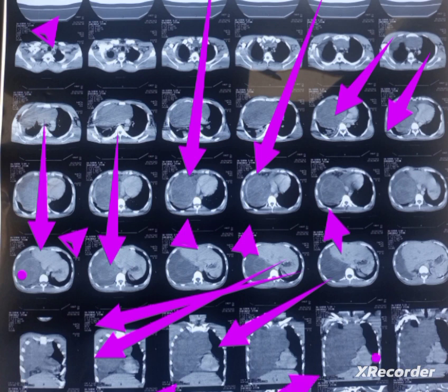So whenever you see a homogeneous opacification that spares the costophrenic angle, you should not go towards a pleural tap — do not put in a needle. Rather, you should do an ultrasound first to confirm, and if on ultrasound you cannot appreciate pleural effusion, you should go for CT with contrast.